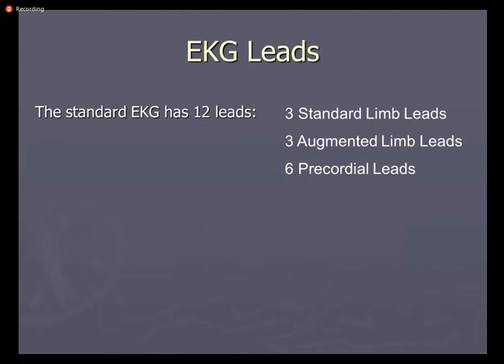Now, why do we use multiple leads? Because electrical activity is present throughout the heart, but we can monitor or see electrical activity from different parts of the heart.